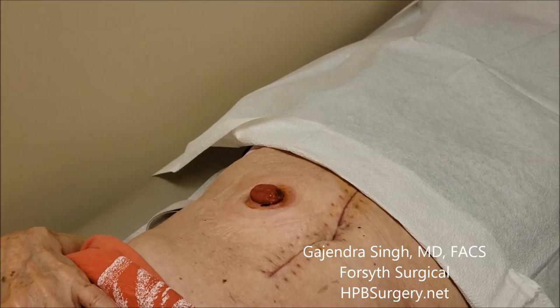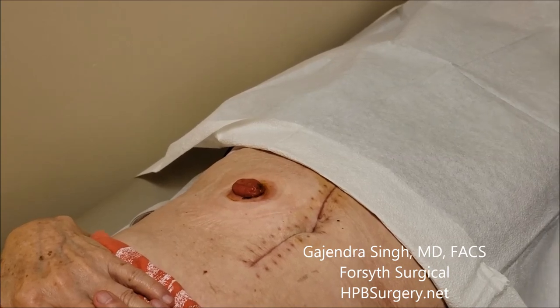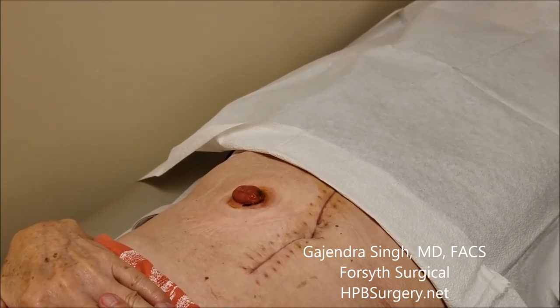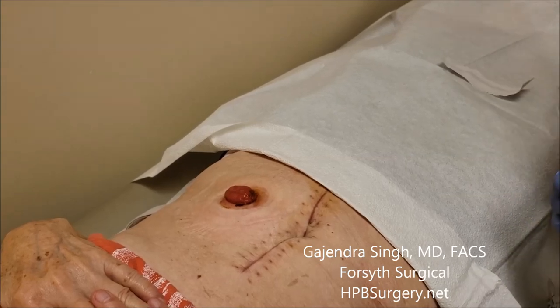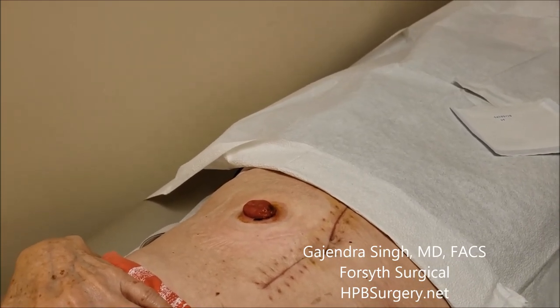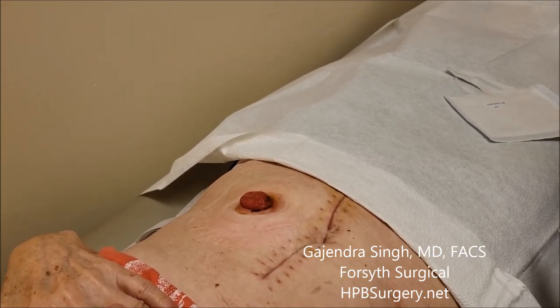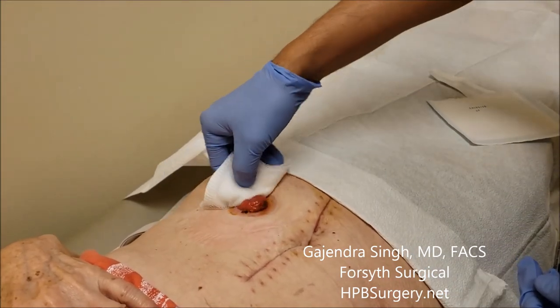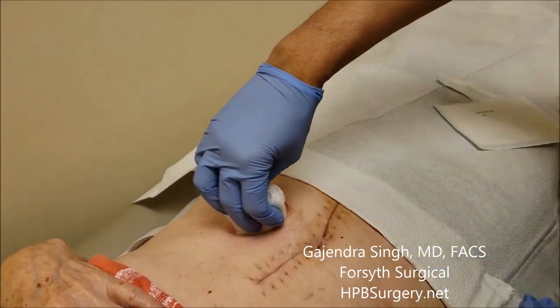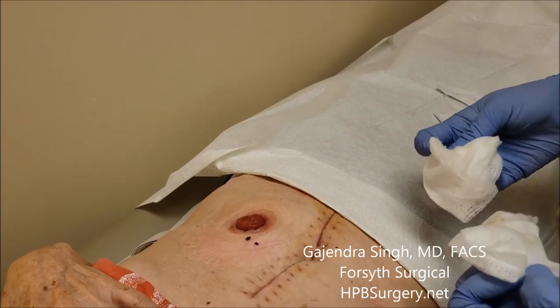The bag is off completely and the colostomy actually looks really nice. Usually you don't have to do a lot of work, but I'm going to clean this up with a little gauze and saline to make sure everything is clean. The ostomy is really nice and pink — a very healthy looking ostomy.